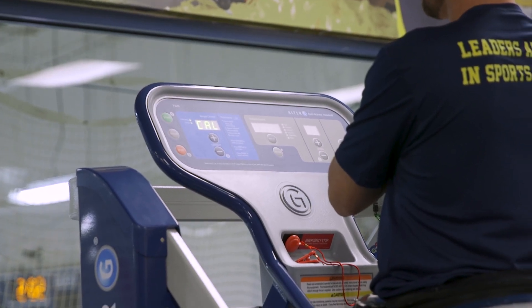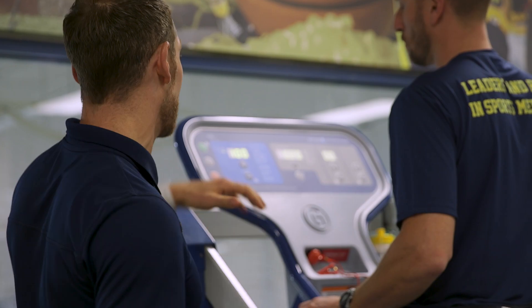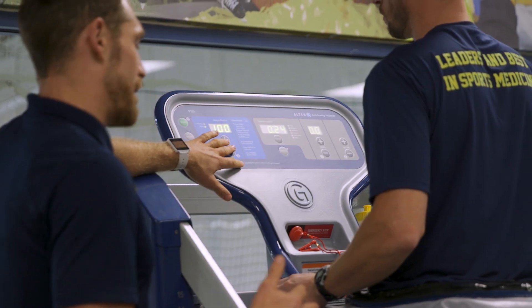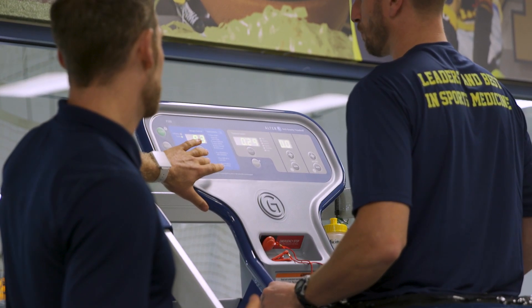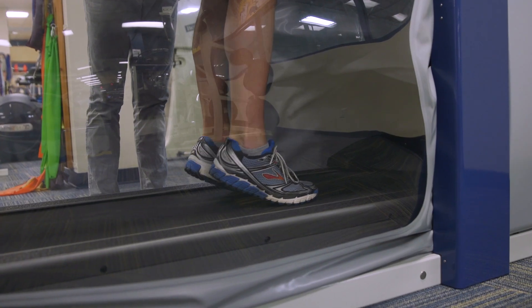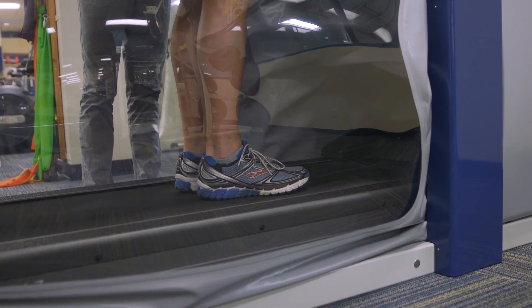As you decrease the body weight, I usually do it incrementally and allow the patient to get used to that level. So let's say we're going to take this down to about 60% body weight — I'll go down 10% at a time, and then I'll just have him do about three or four heel raises, just to kind of get used to that different weight bearing.